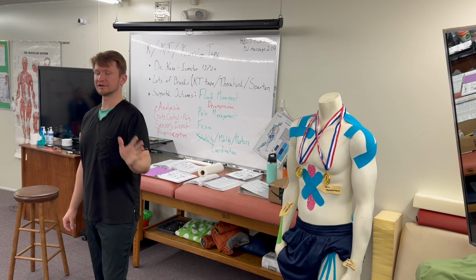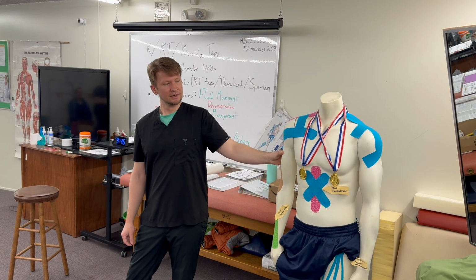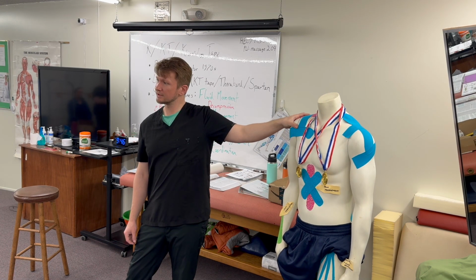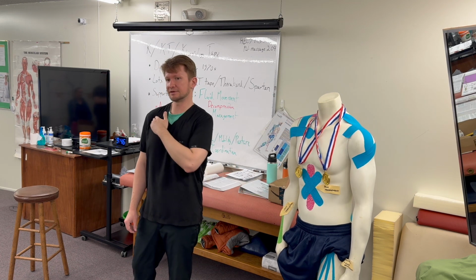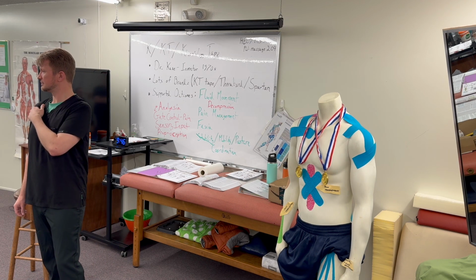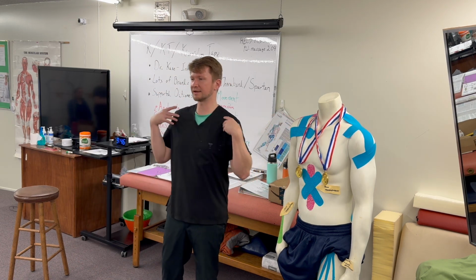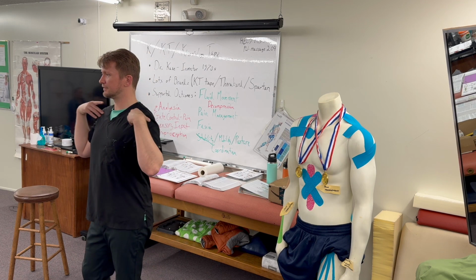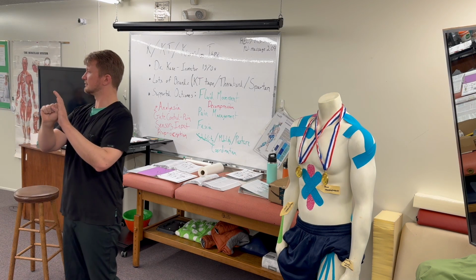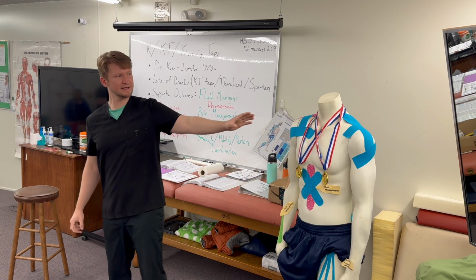Same thing, in my opinion, related to posture. The benefits of this one right here, the shoulder one. New research has shown that actually there may be something to this one and versions of this in creating some space for the shoulder joint. The way I perceived it and learned it, it was more about correcting the orientation of the shoulder girdle so that the humerus, the head of the humerus, is just set in the socket better. But I mean, we're talking about posture ultimately, right? There's some way here of taping this.